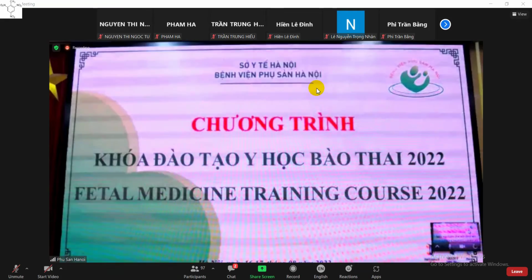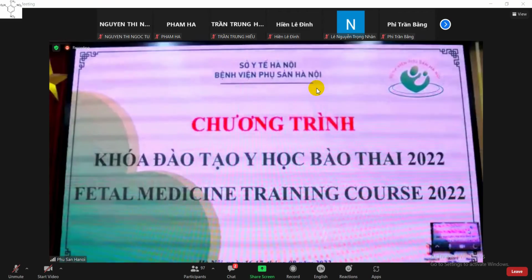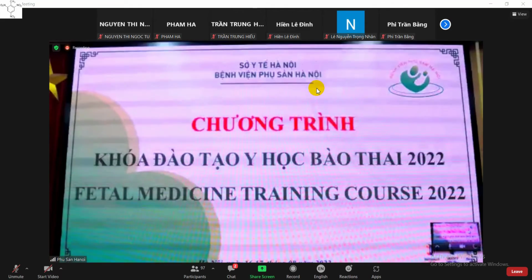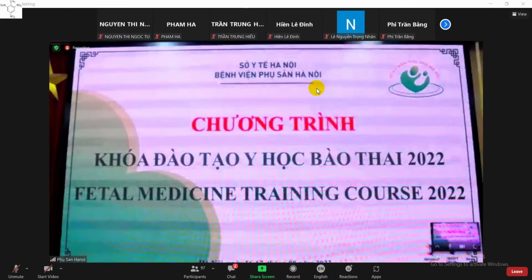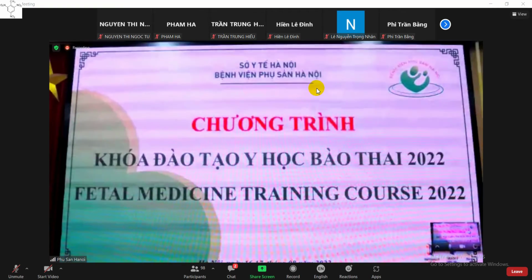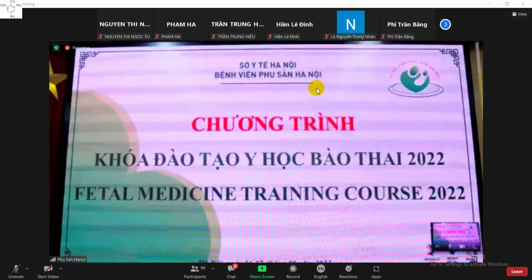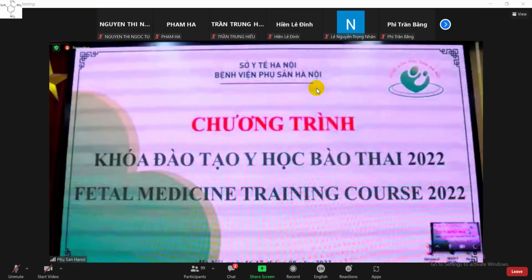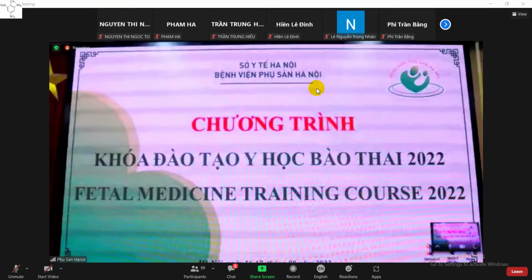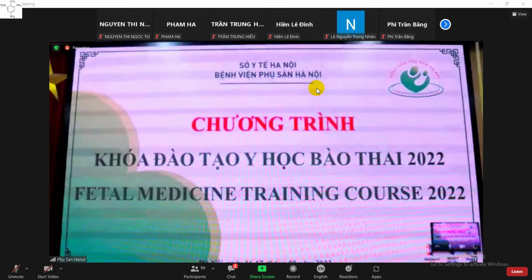I think you're spoiled for choice for drains these days, actually. I think Eve uses Harrison shunts most of all. I started to use them, but I found that especially with thoracic insertion, if there is edema of the thoracic wall, they can sometimes pinch off and block, whereas the Rodeck shunts that are silastic and tougher don't tend to do that so much. But as I indicated, Rodeck shunts are temporarily being revised by the manufacturer regarding the plastic they're using, so they've taken them off the market.